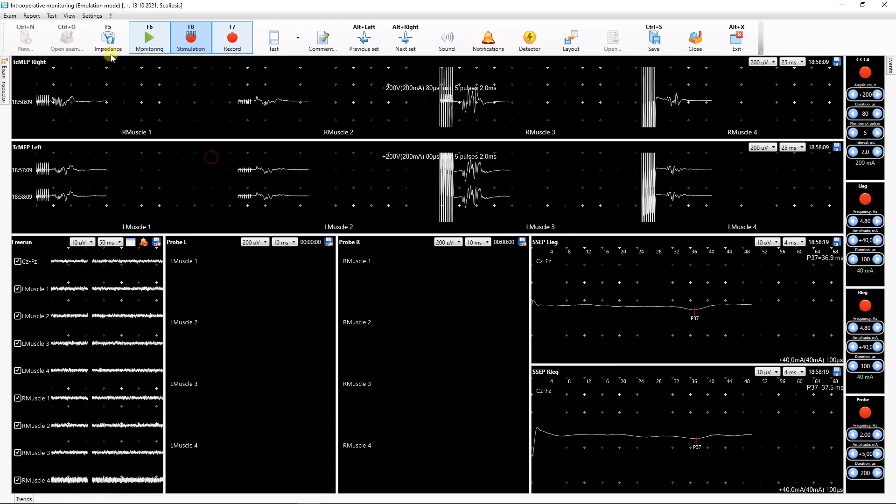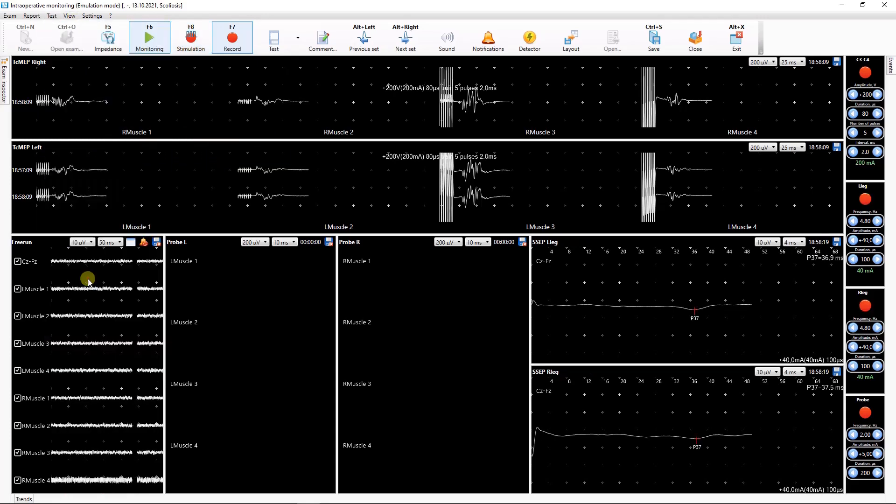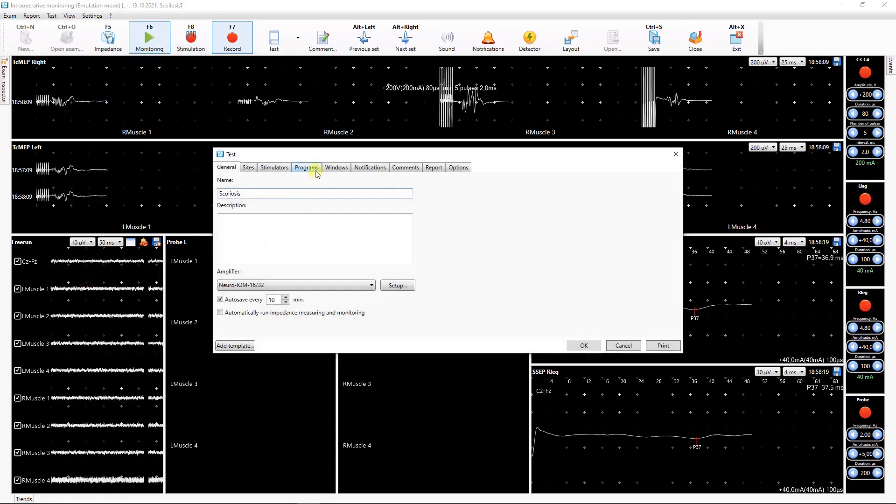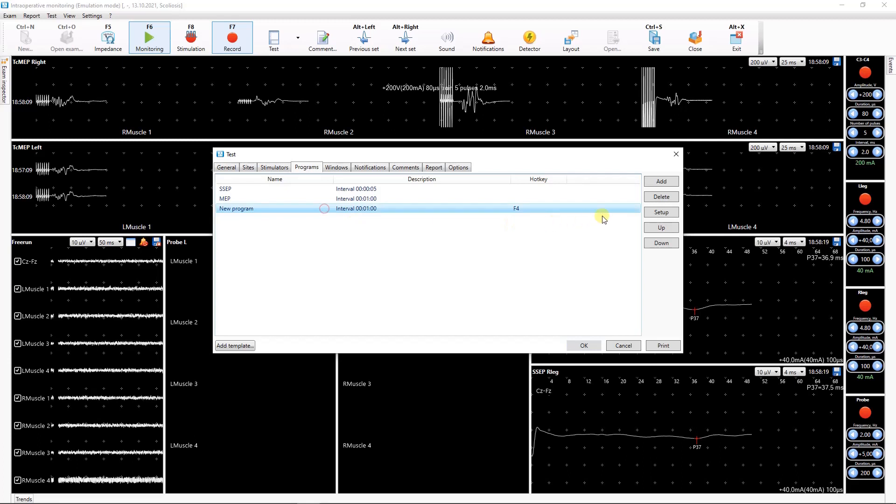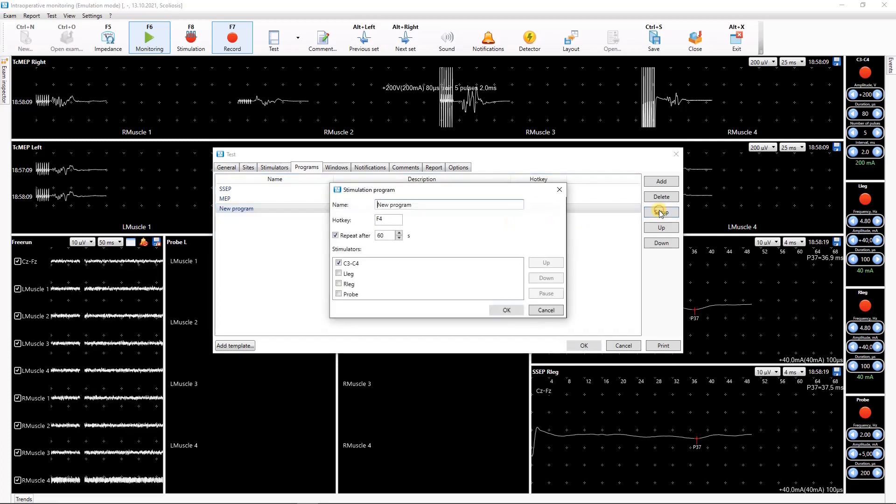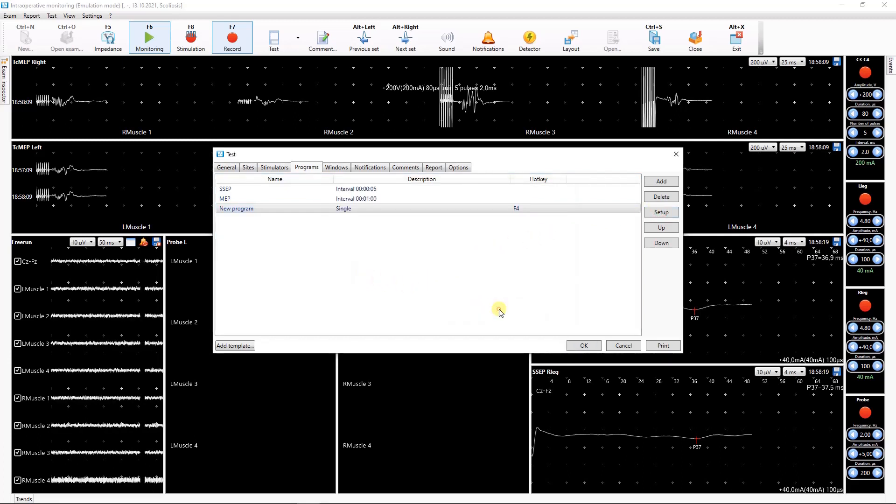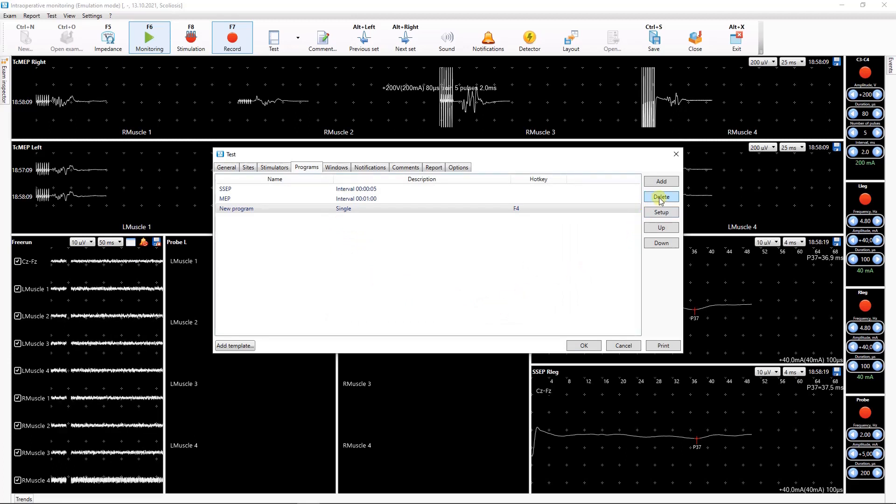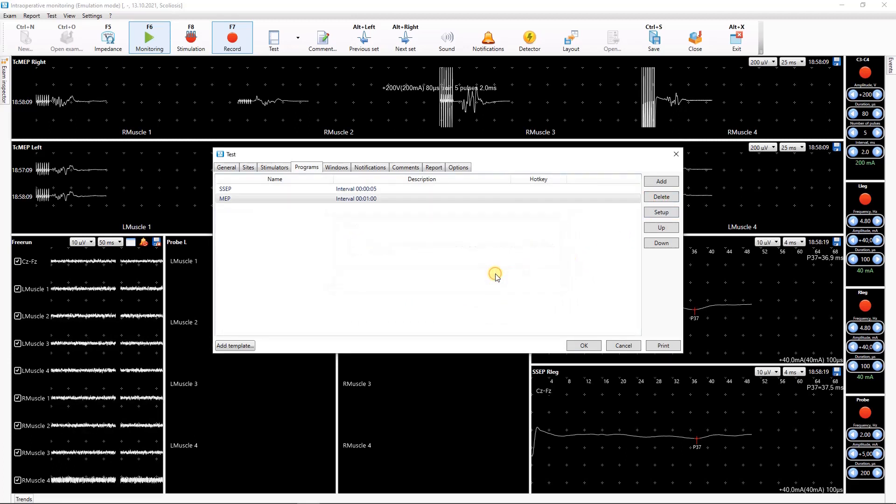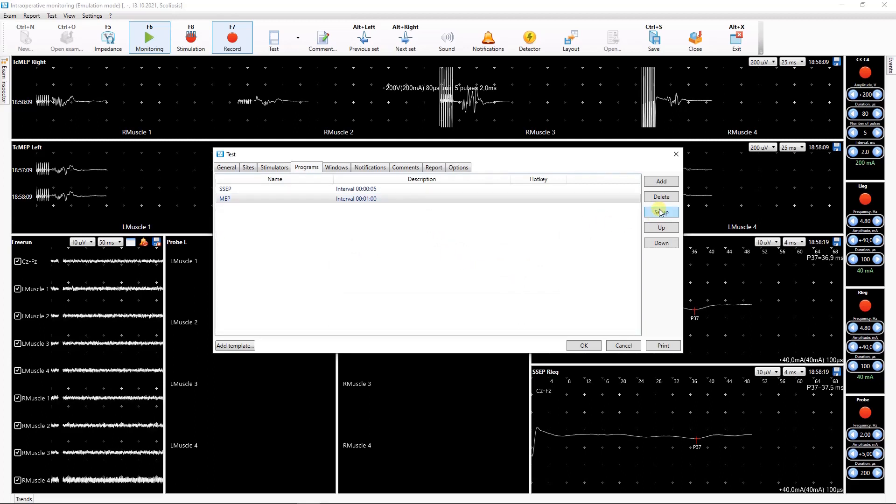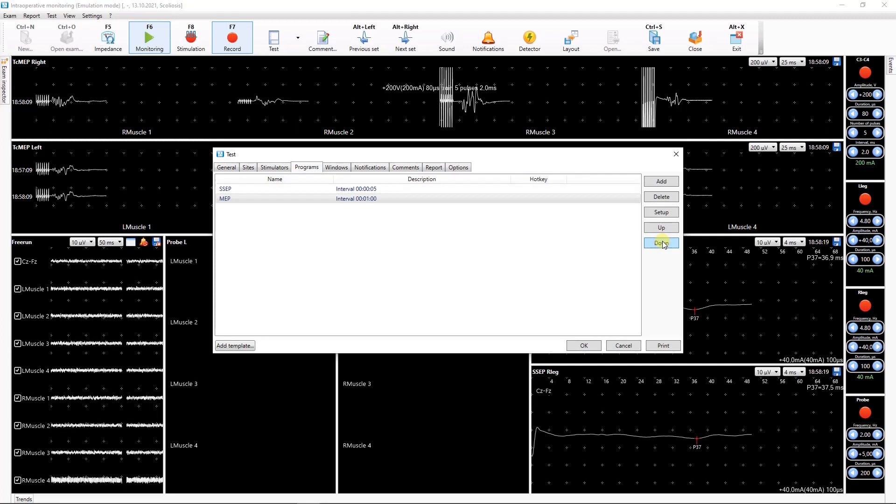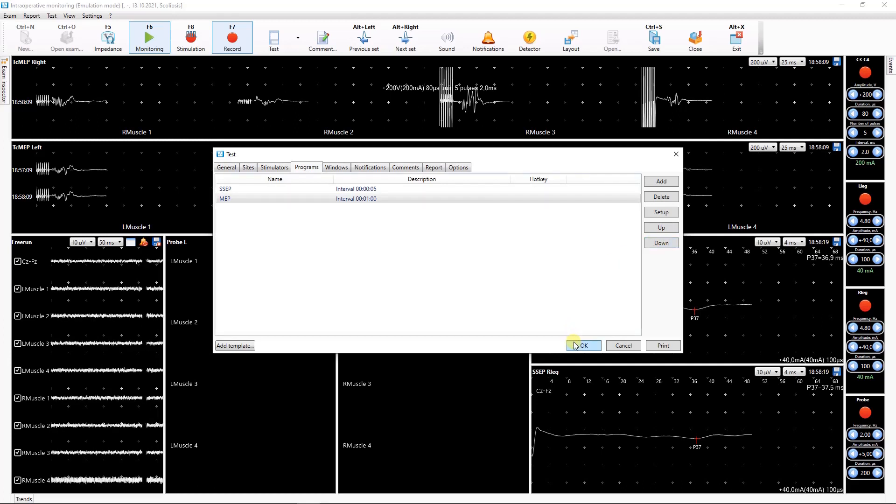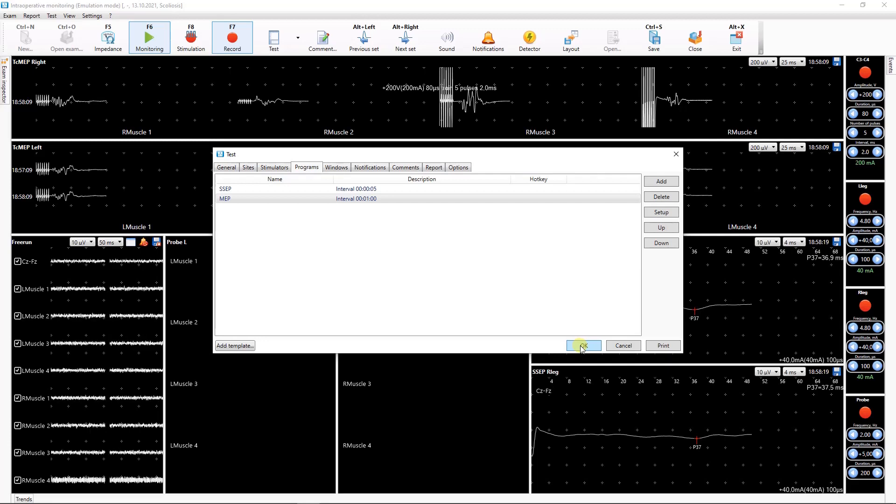Let's return to the program list. To change Stimulation program settings, click Change and adjust the desired parameters in the dialog box. To delete the program, select it and click Delete. Here you can also change the order of programs in the list using up and down buttons. When the necessary settings to the list of Stimulation programs are made, click OK or continue with other settings.